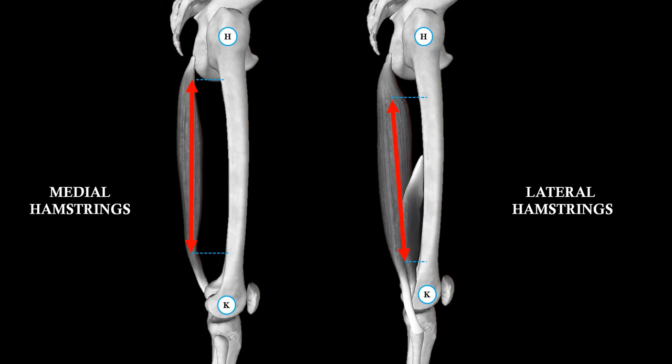You get a global assessment of muscle activity in most instances. However, as we said, with very long muscles, perhaps not. You may need to apply two sensors, but then this starts to cause an issue with the fact that you need to position your sensor near the muscle belly, and if you start to position it nearer the tendon, that's a region where you see fewer nerves. It's less well innervated, therefore there's a bit of a trade-off there. So there's pros and cons to both.